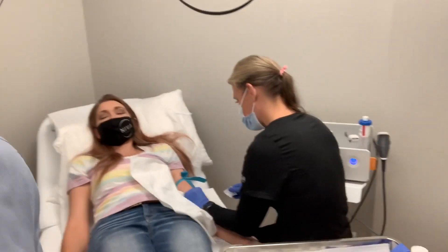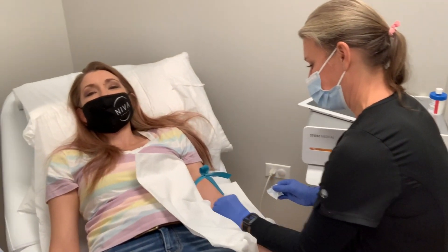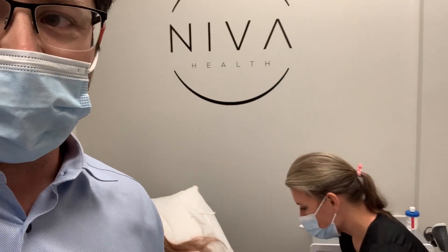What's up guys? Dr. LaMarche here. This is my wife, the other Dr. LaMarche, Dr. Rebecca. This is nurse practitioner Danielle, and we are going to take some of her blood, spin it and concentrate the platelets. So we're doing PRP and we're actually going to inject it in her SI joint.